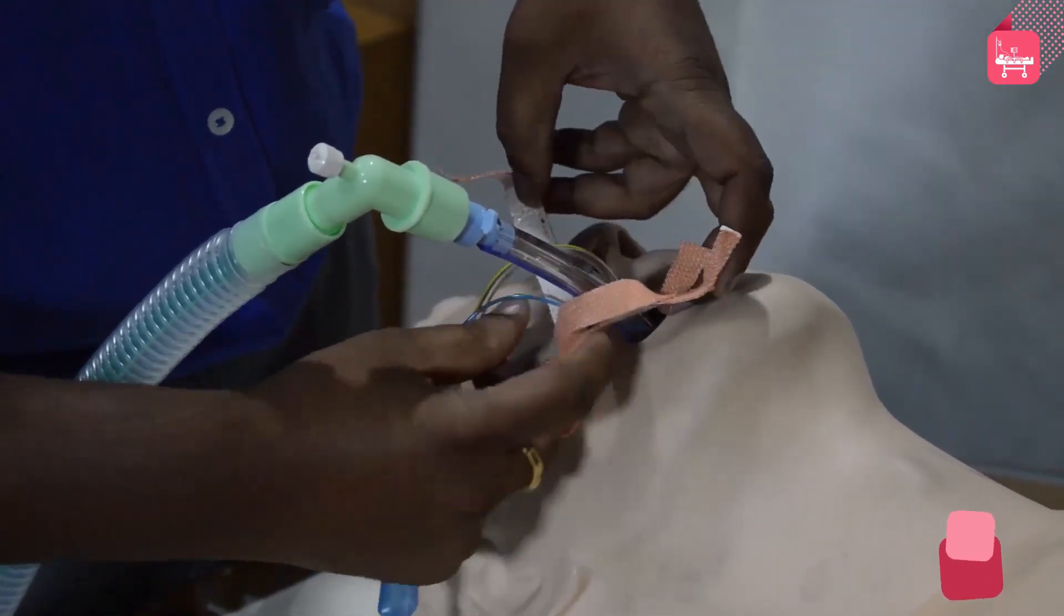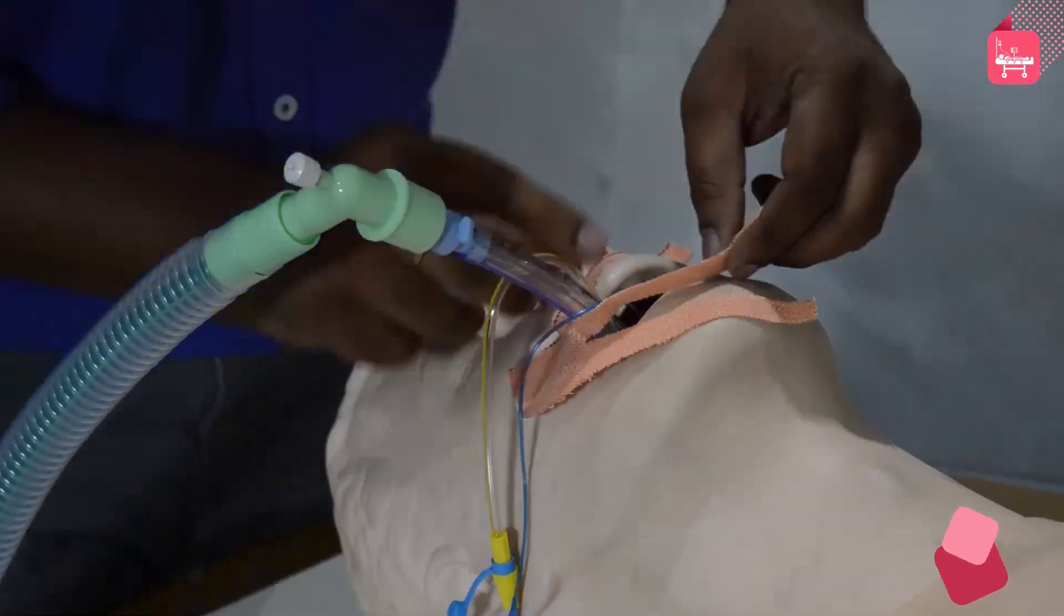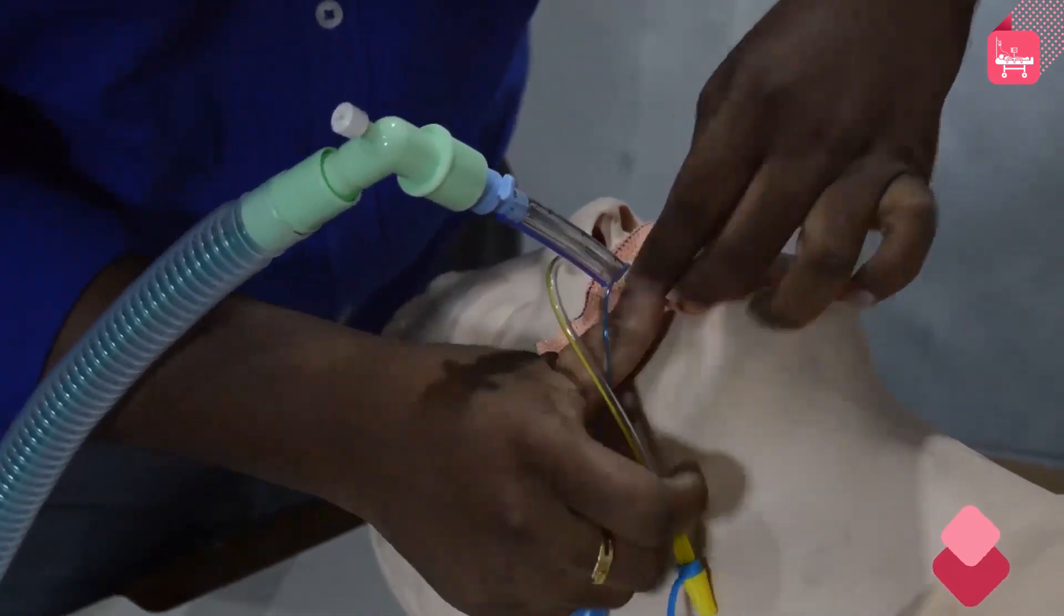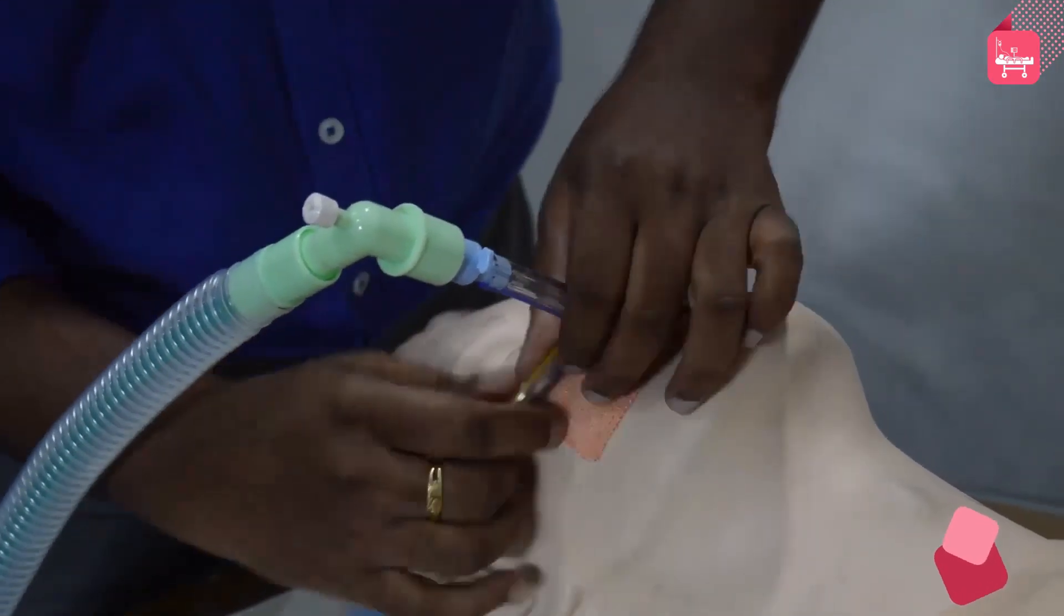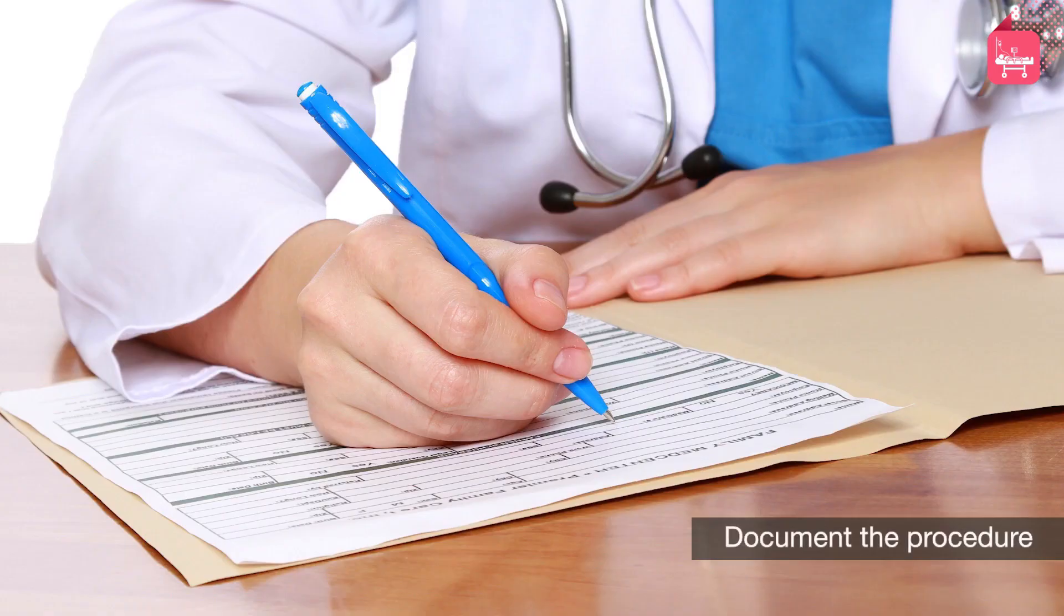Other ways to fix include use of twill tapes or tube fastener devices. Remove the gloves and discard them. Perform hand hygiene and document the procedure.